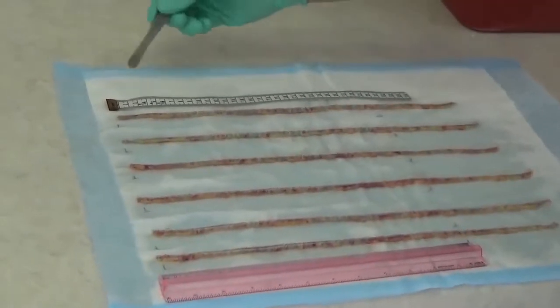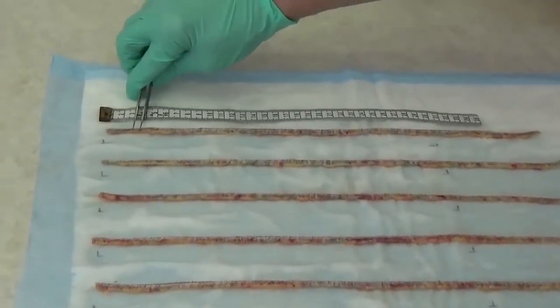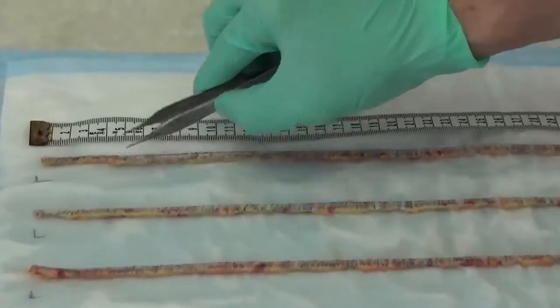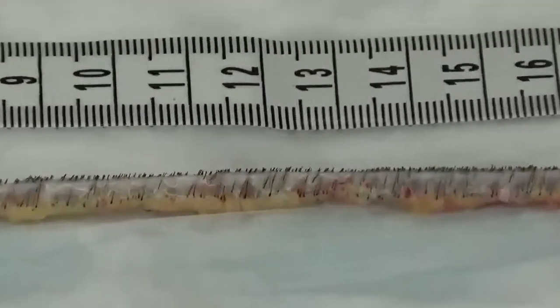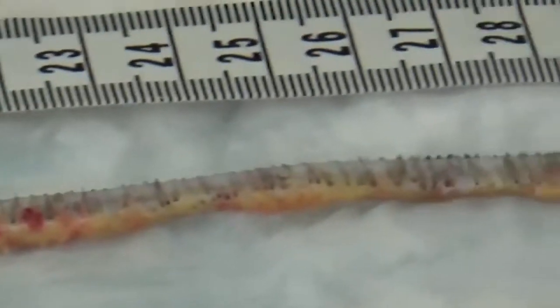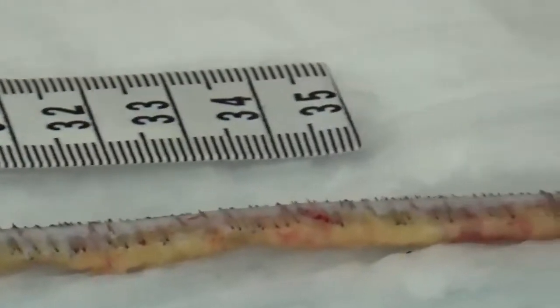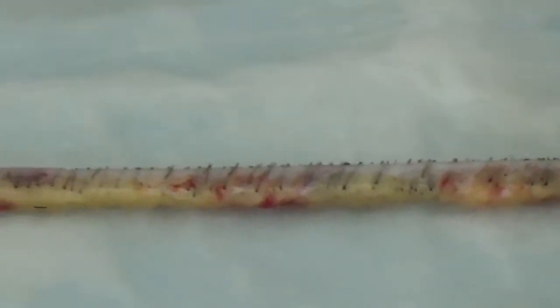What's so important, if anyone watches my videos, is to look at the level of transection as far as how the grafts are cut and if there's any transection of the follicles. And as you can see, I consistently got 6 gorgeous strips, which is going to yield this patient a lot of hair. I'll lowball the numbers and say he has about 15,000 hairs here in this particular case. So it was an excellent harvest.